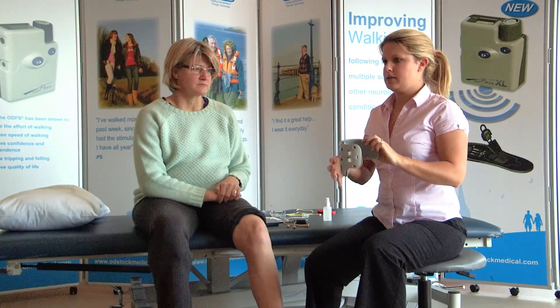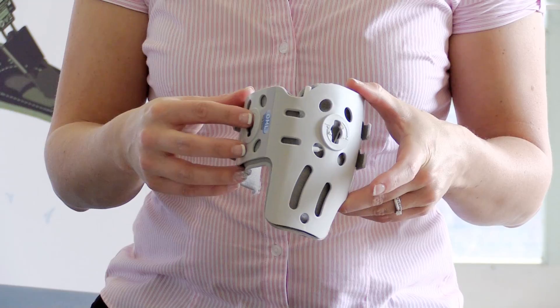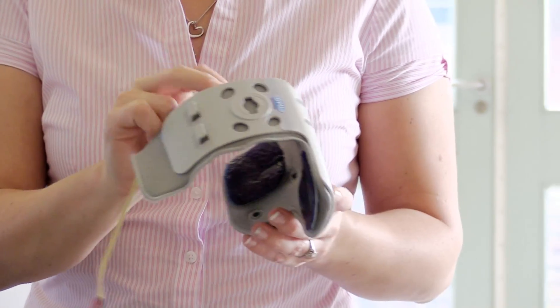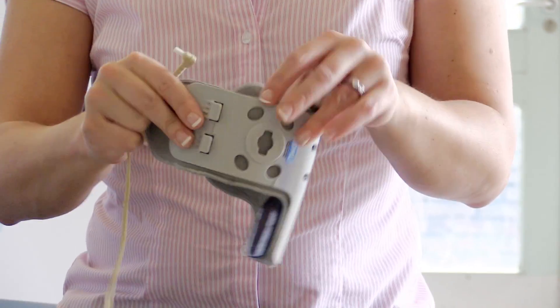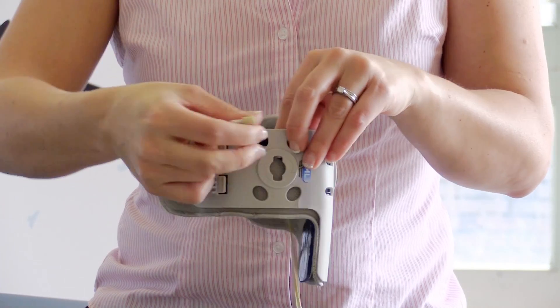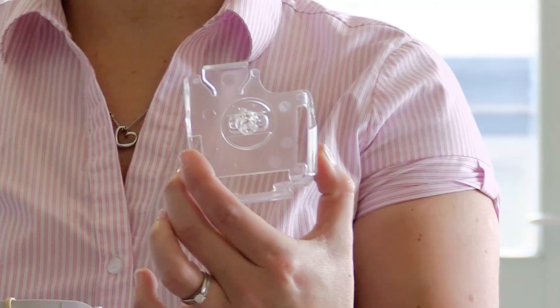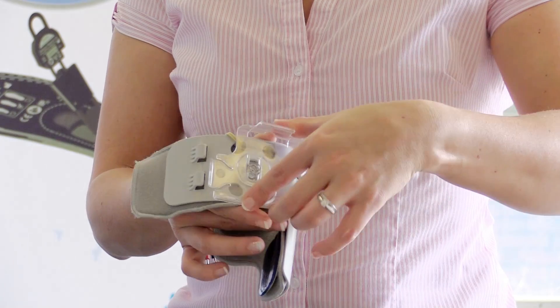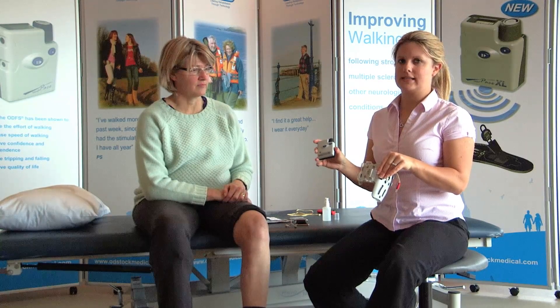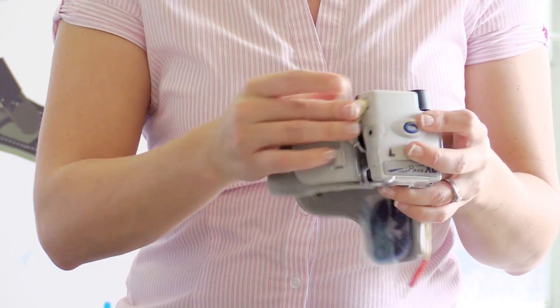Ask the patient whether they wish to use the Pace on the medial side or the lateral side, as this is where you will attach the holder. If they have chosen the medial side, thread the electrode lead through the nearest oval hole to where the Pace electrode socket will be positioned. Then take the holder, place it into the attachment point, and gently rotate. Take the ODFS Pace or Pace XL, place it into the holder, and connect your electrode lead.